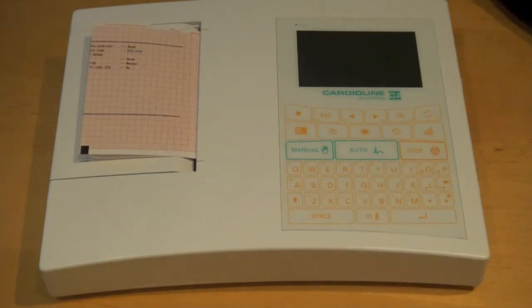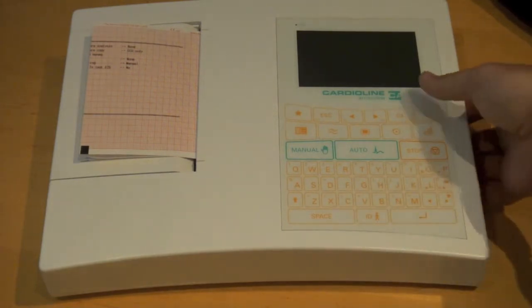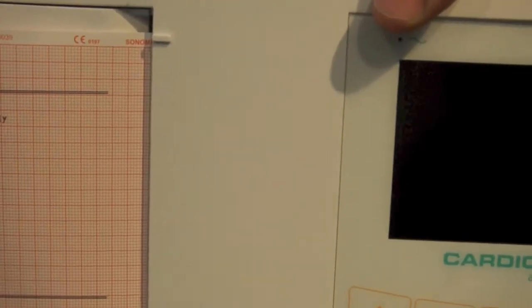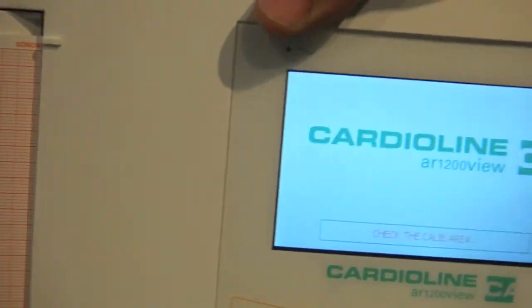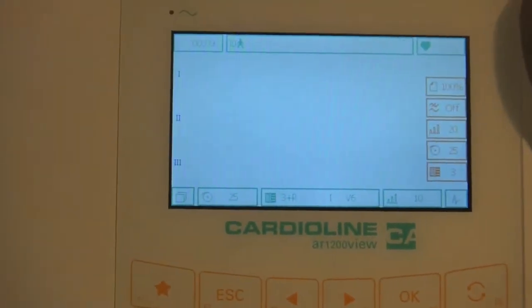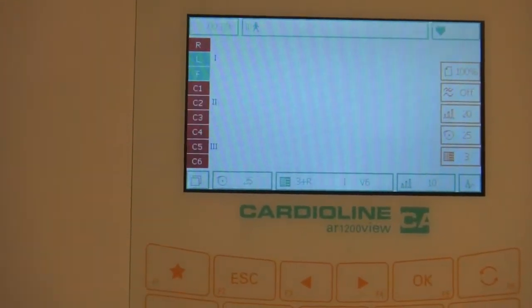This particular machine has, as I mentioned, the preview screen on it. I'll go ahead and power the machine, and you can see Cardioline only offers color screens.